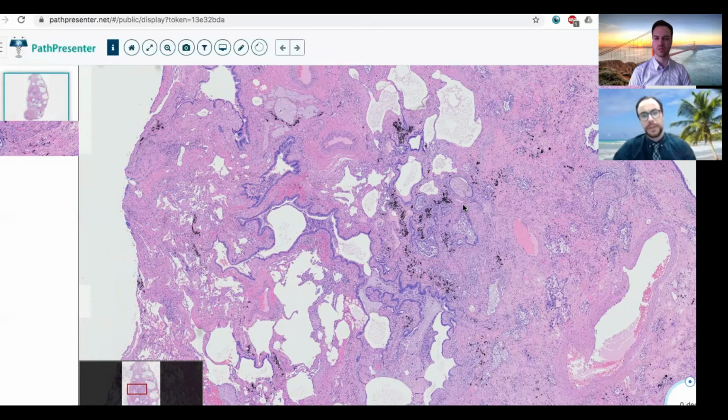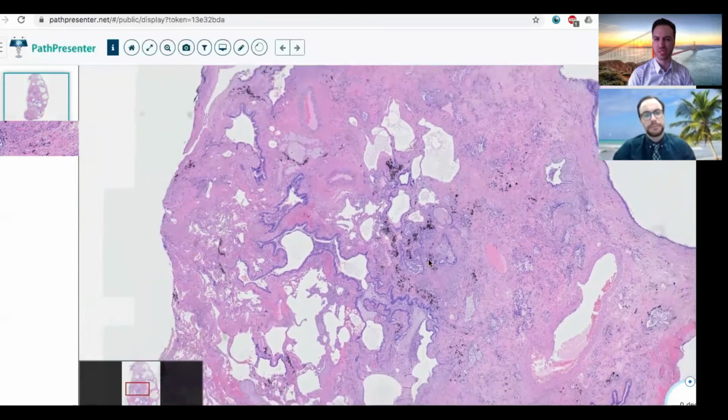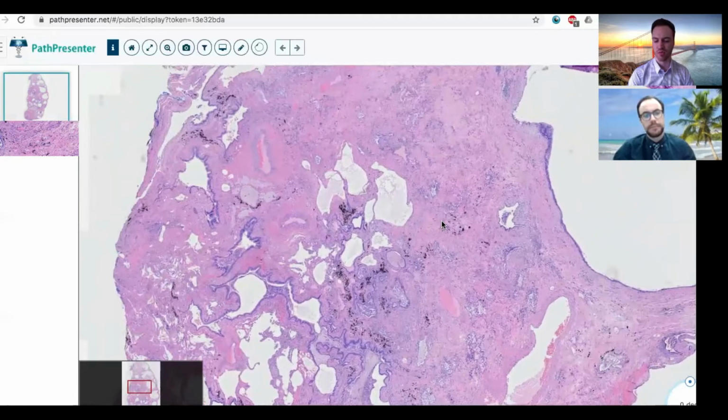Okay. Do you know the classic presentation of these cases? Like what would be the demographics for what you would expect? So I think for UIP, it was mostly men over 50 years of age. Yeah, even a little bit older, typically in their 60s, 60, 65 is the typical. NSIP was younger. Yeah, it can be younger. 30s, 40s. Yeah, or a little bit older than that as well, but within that range.